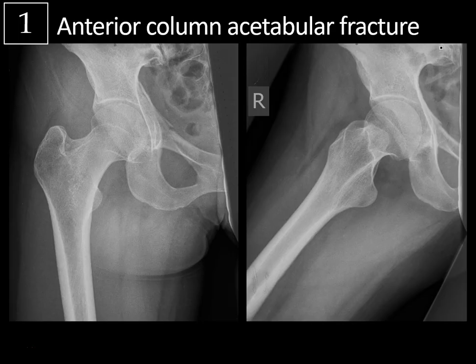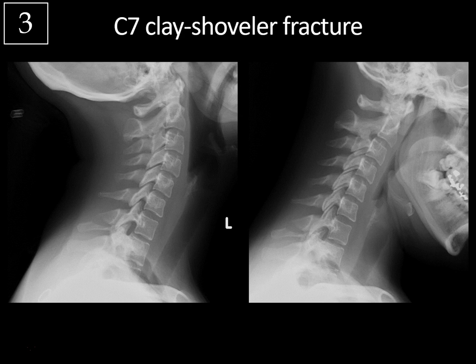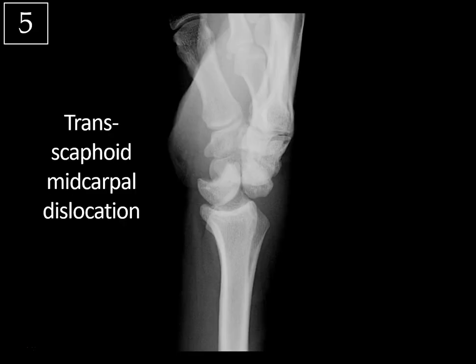Rapid review: Case 1, anterior column acetabular fracture — look at the iliopectineal line for anterior column fractures, the ilioischial line for posterior column fractures, and the medial teardrop for medial column fractures. Case 2, osteochondritis dissecans — most commonly in the lateral aspect of the medial femoral condyle; look for instability signs including a free fragment on x-ray or the T2 rim sign on MRI. Case 3, clay shoveler fracture — most commonly at C7; the spinous processes should be on your cervical spine lateral checklist. Case 4, calcaneal lipoma — well-circumscribed lucency with central calcification (cockade sign); benign, most common in the calcaneus. Case 5, trans-scaphoid midcarpal dislocation — use the lateral view to evaluate carpal bones, and differentiate perilunate, midcarpal, and lunate dislocation by the lunate's relationship with the radius.